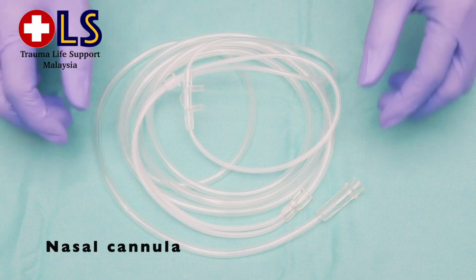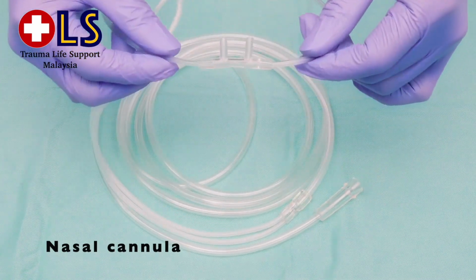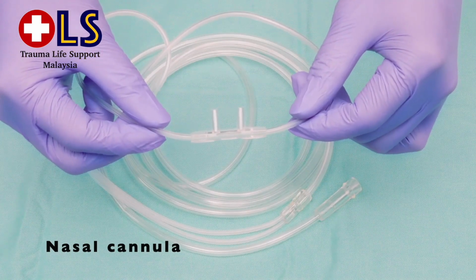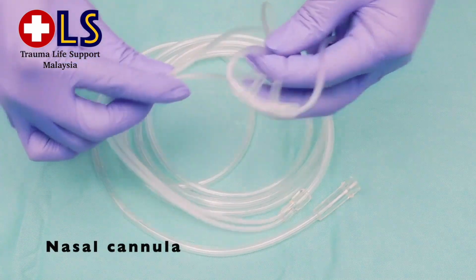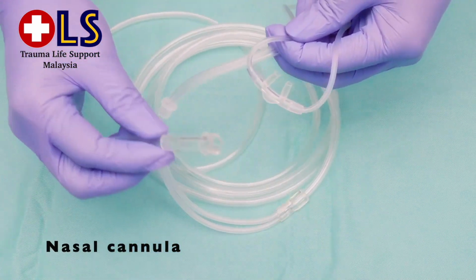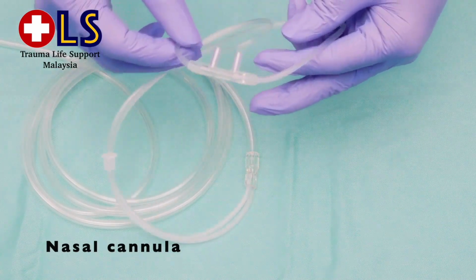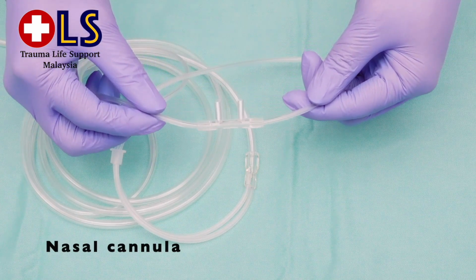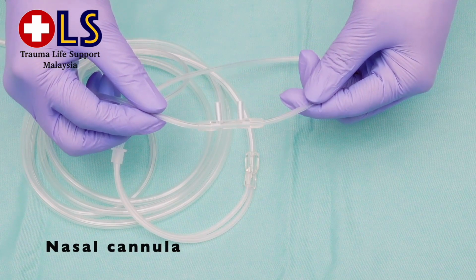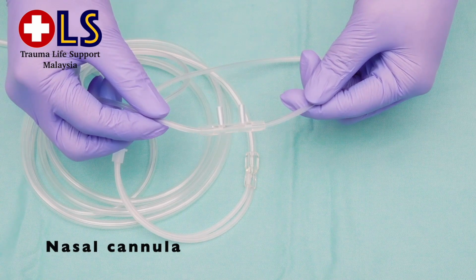Let's learn. This is nasal prong, or known as nasal cannula. Connect the nasal prong to the humidified oxygen supply and set the flow of the oxygen not more than 5 liters per minute, which delivers oxygen concentration of 28 to 44%. Anything higher than 5 liters per minute can result in discomfort, drying of nasal passage, and epistaxis. Also, flow rates of more than 5 liters per minute would cause laminar flow to become turbulent, which is less effective.